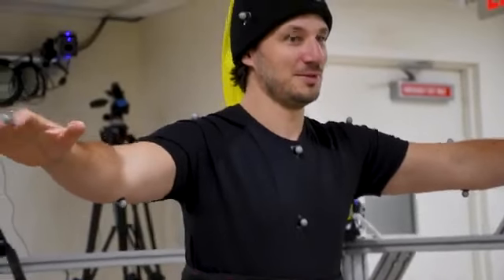Victor Santamaria, Ph.D., MSc, PT, Assistant Professor, Physical Therapy. I'm Dr. Santamaria, and I'm an Assistant Professor of Physical Therapy at NYMC. He navigates around a 3D environment on a computer with dots mapped in 3D space.